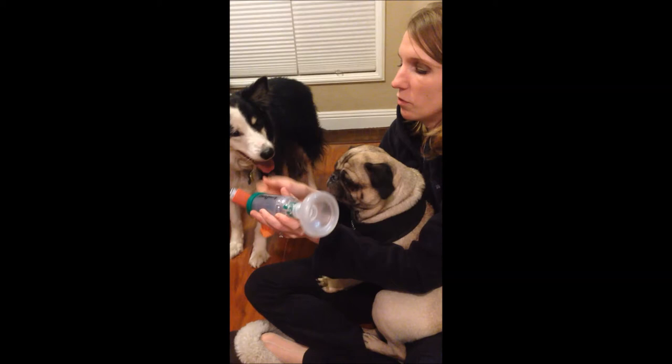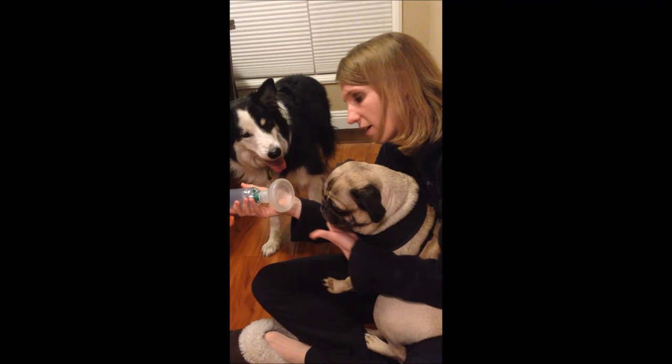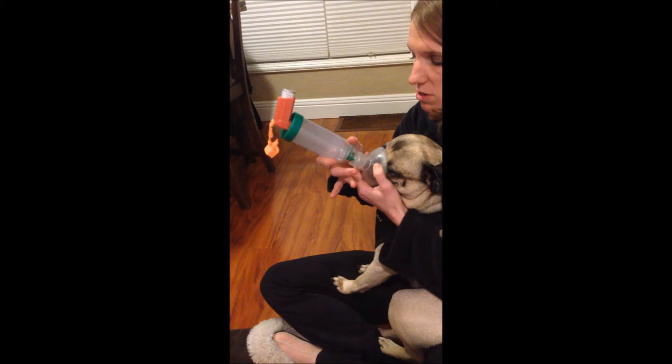So the first step — that needs to be up, I think, that's how I use it. This just fits in here and then that needs to go over his entire muzzle before doing the squirt.